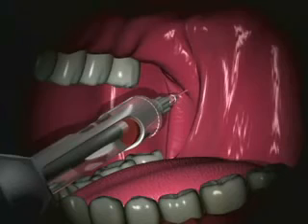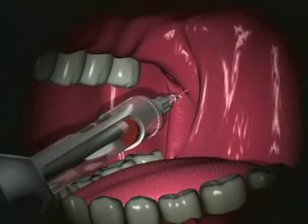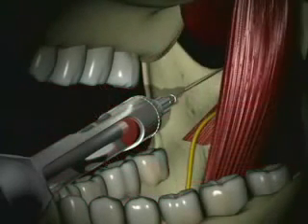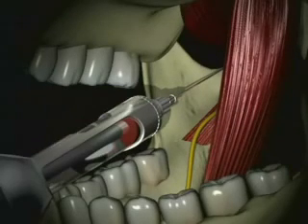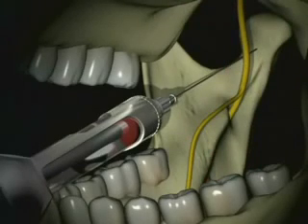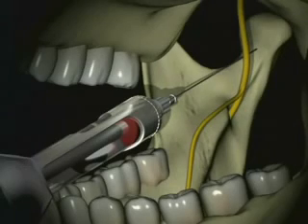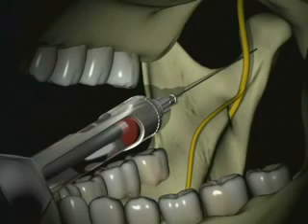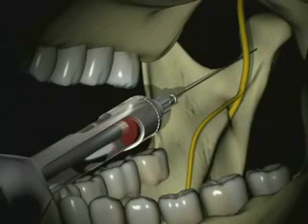It is important to note that if bone is not contacted, one should not inject, but redirect until the neck of the condyle is contacted. The injection site is bounded by the medial pterygoid muscle and the sphenomandibular ligament medially, the lateral pterygoid muscle superiorly, the ramus laterally, and the neck of the condyle posteriorly. We should ask the patient to keep their mouth open for about one minute if possible, as it is believed that this keeps the mandibular nerve closer to the site of injection and therefore improves onset of anesthesia.